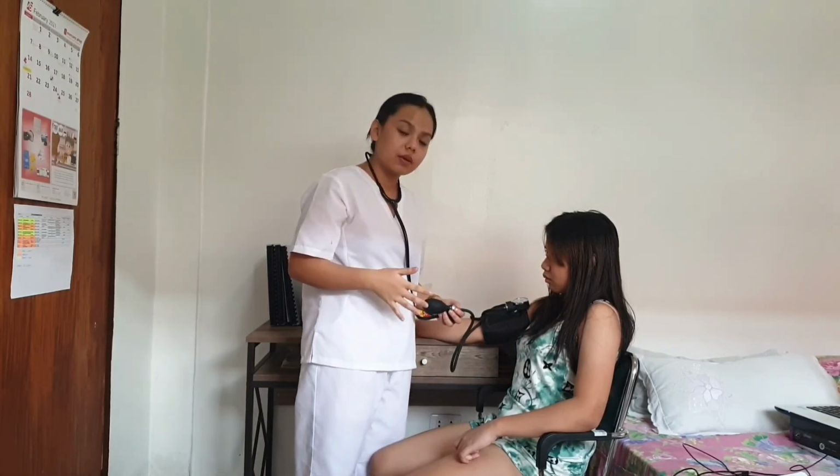But then again, I'm going to give the patient 1 to 2 minutes to rest. It has been 1 minute, and I'm going to reassess the blood pressure of my patient to confirm the accuracy of my first reading.